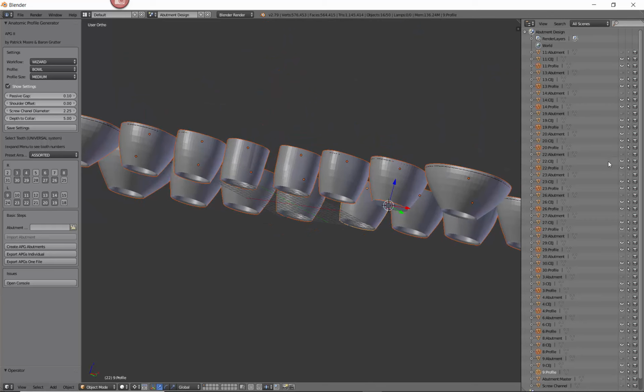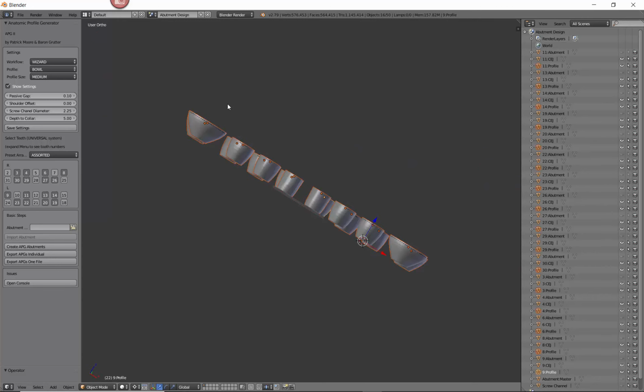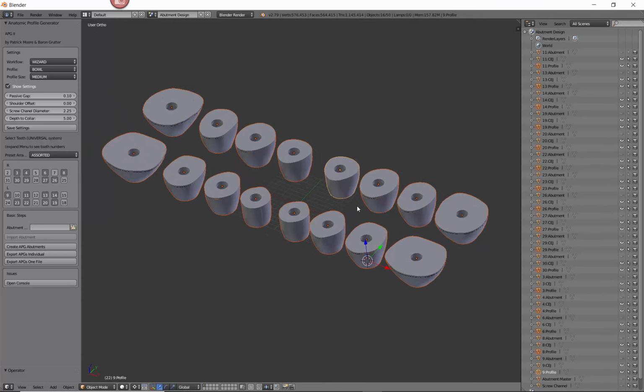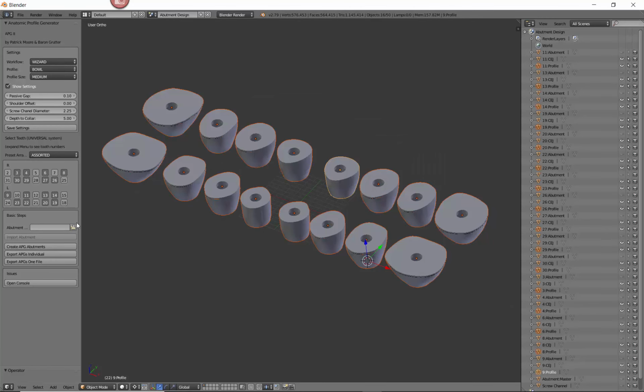So that's it. That is how you generate a set of these sleeves from an abutment that you don't have a digital file of, and you just have it in hand, and you want to take some quick measurements, and then write these down. You can even export the abutment to save it so that you have it later. And I'll show you real quick how to do that.